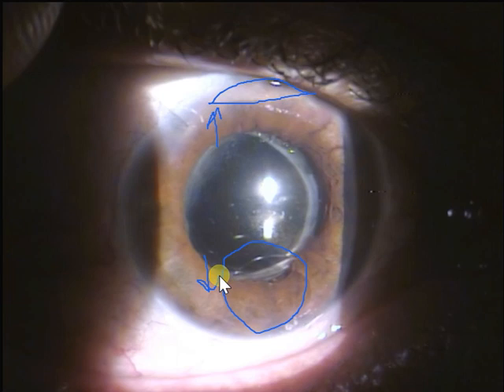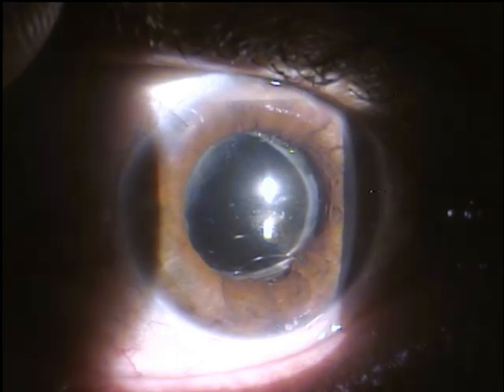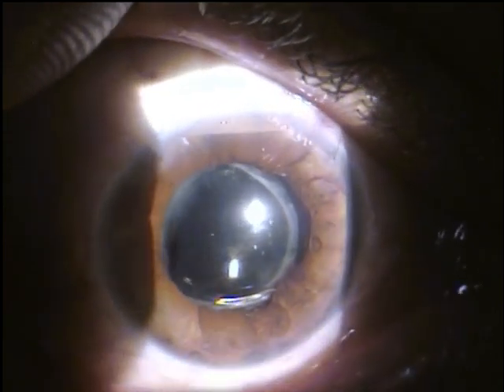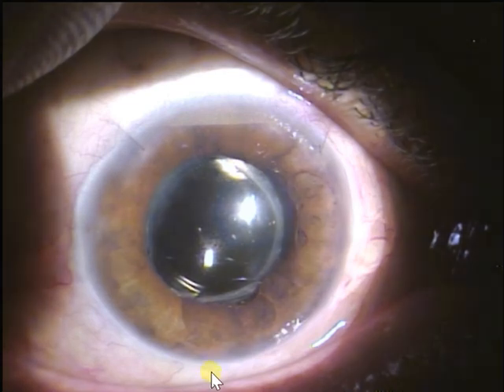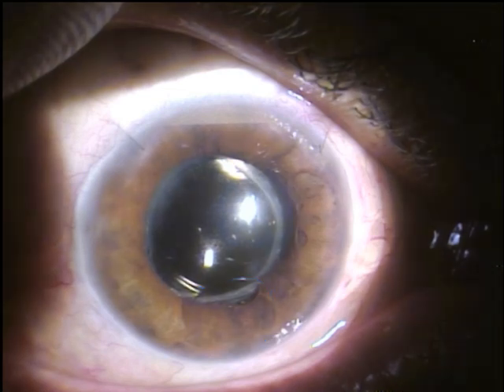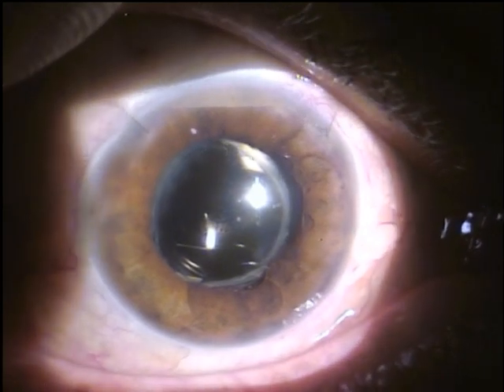It's easy to remove. With that perfluorocarbon, somebody needs to have the patient sitting up and then go from inferiorly with a needle, and you need to aspirate that, and that is sometimes very tricky to get rid of. And that's why when you're doing perfluorocarbon exchange, you need to be very careful to remove that perfluorocarbon all the way out. Now you can see easily that bubble of perfluorocarbon, and it's going to stay there inferiorly. Long term, it can cause a bit of corneal endothelial decompensation in these cases.